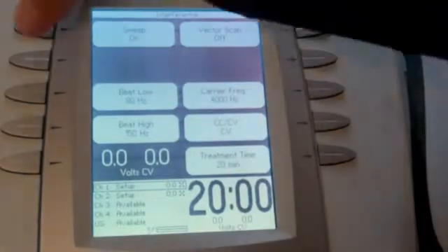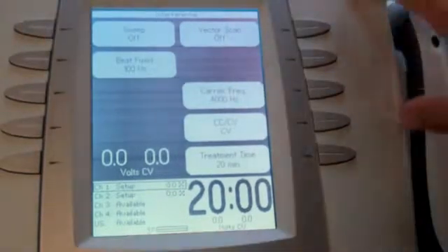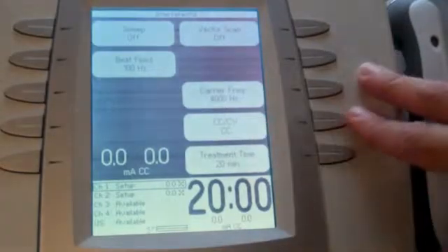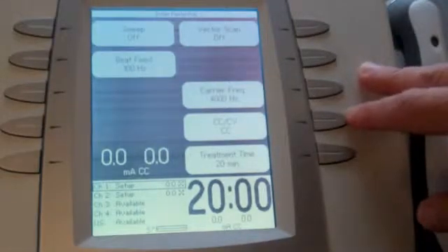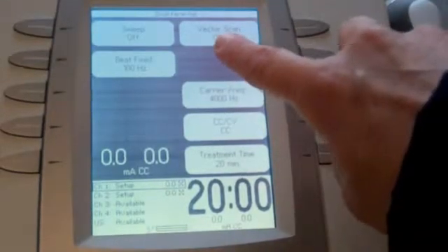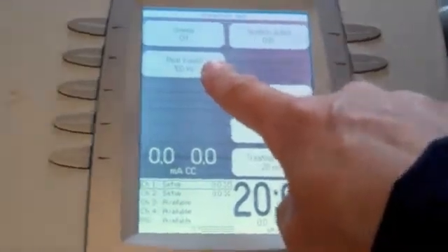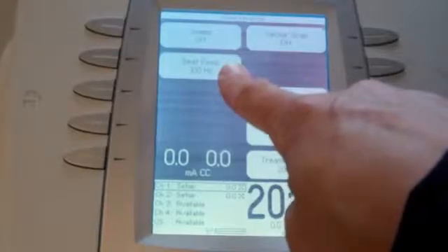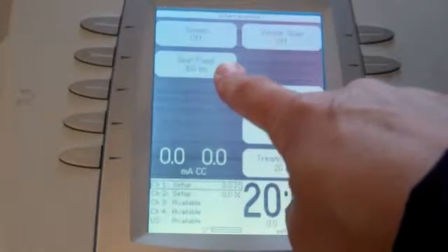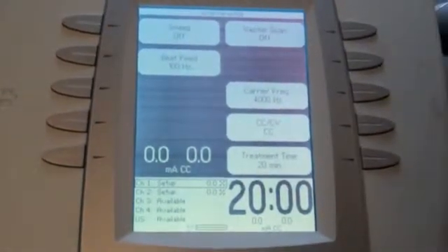For this particular modality, we're going to put the sweep on off, so our value stays the same, and we want a constant current, so go ahead and switch that to CC. The carrier frequency will remain at 4,000, and the vector scan, just for simplicity, we're going to keep it off. So the number that we want to make sure is right here is our beat frequency, and for sensory level pain control, we need that to be between 80 and 200 pulses per second, which a pulse per second is a hertz, and right now it's set at 100 pulses per second, so that should be fine.